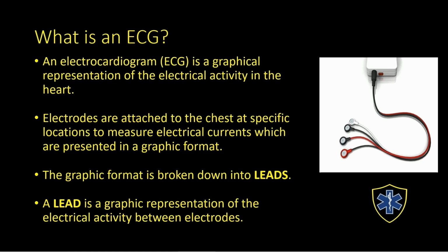The graphic format is broken down into different leads. The lead is a representation of electrical activity between one or more electrodes. When we talk about the limb leads, it's between two electrodes. However, in some cases, it's only monitoring from one direction, in which case it's a unipolar lead. So let's look at some of the electrodes here.